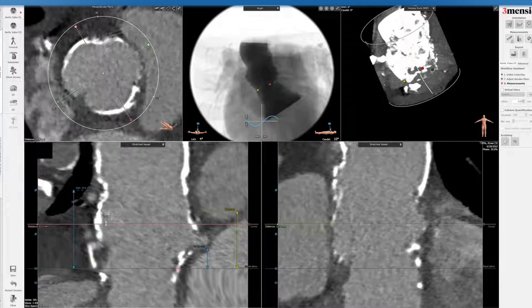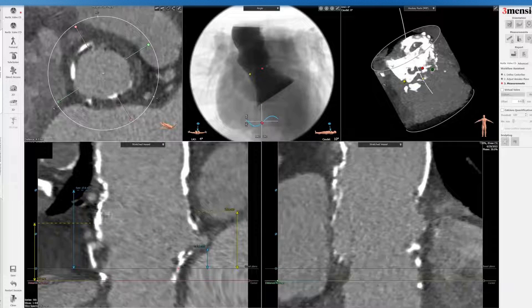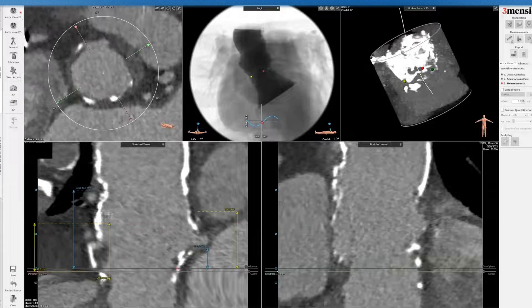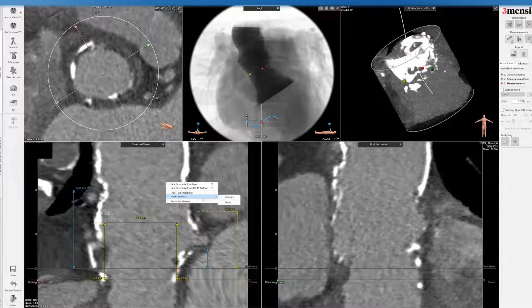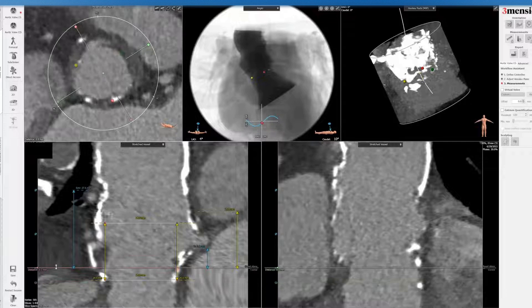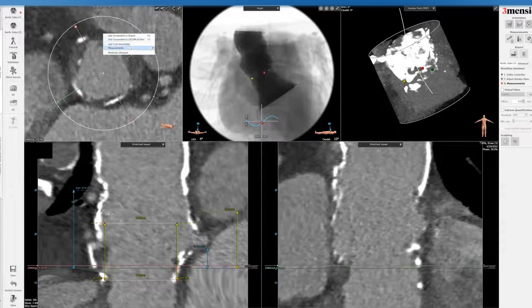I'm going to draw a box representing a 26mm balloon expandable valve just to see how it looks. Remember, these aortic roots are quite non-compliant because they're completely calcified, just like a porcine xenograft, and so keep in mind the valve may not fully expand completely. You also want to make sure there's no risk of root rupture when you inflate the balloon inside this anatomy. If you do choose a balloon expandable valve, I would then do the ellipse, keep circular, and put a 26mm circle in there to see how it fits.